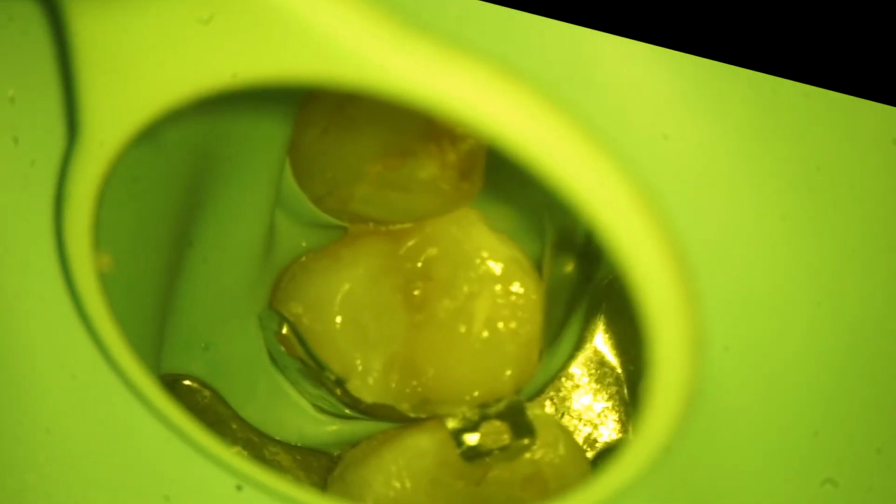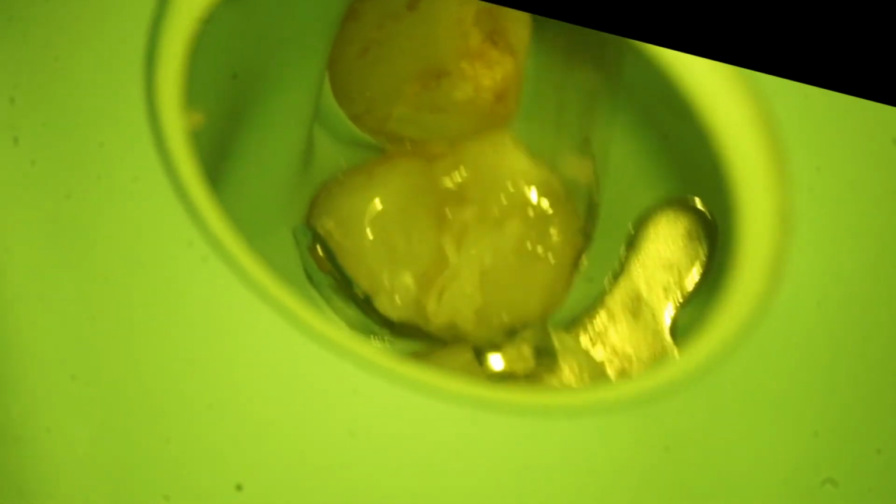So here we're building the buccal cusp where we'll use a micro brush to blend this composite. The more finishing we do with fine instruments, the less hard work we have to do towards the end of the restoration. So here our buccal wall is almost complete. Now we'll make the palatal cusp. This increment will be used to make the palatal cusp. Once we are done with the palatal cusp, we will be making the marginal ridges. And after the marginal ridges, we'll just be giving some finishing touches.